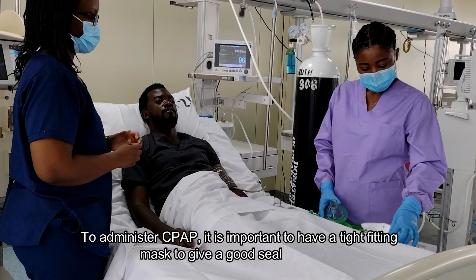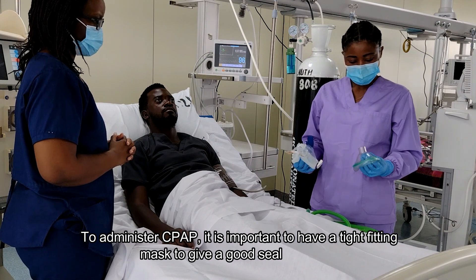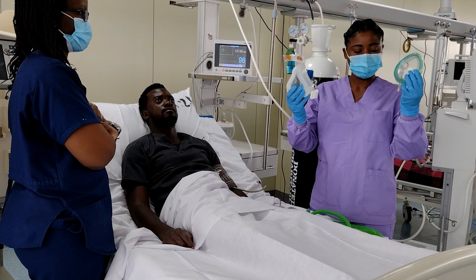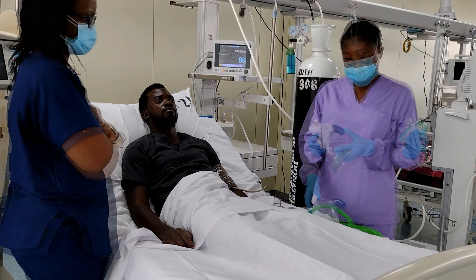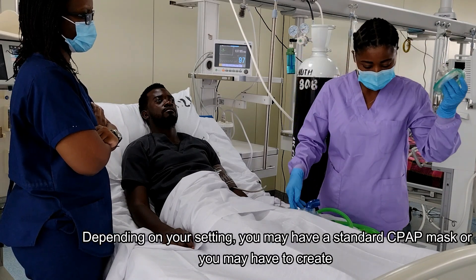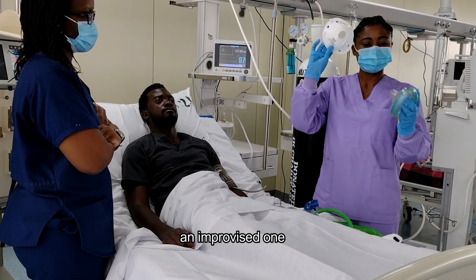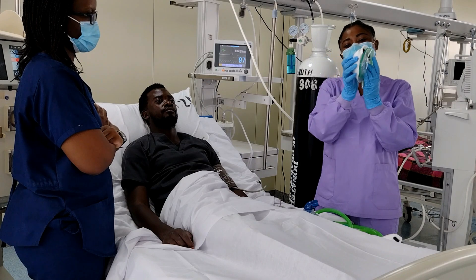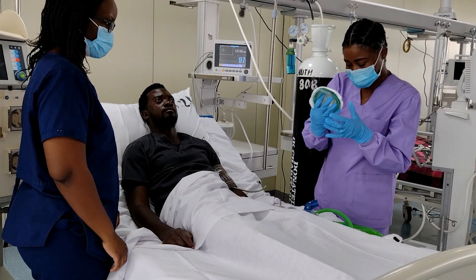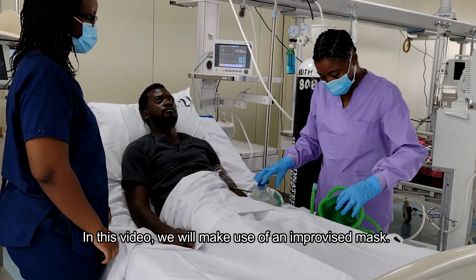To administer CPAP, it is important to have a tight-fitting mask to give a good seal. Depending on setting, you may have a standard CPAP mask or may have to create an improvised one. In this video, we will make use of an improvised mask.